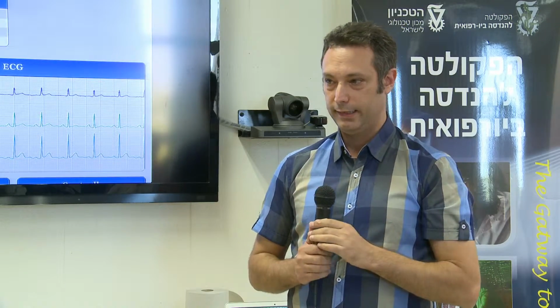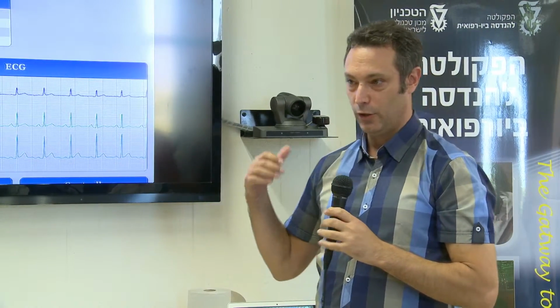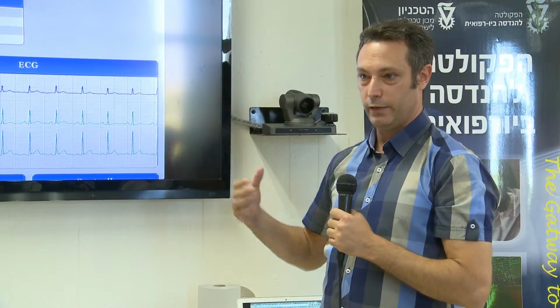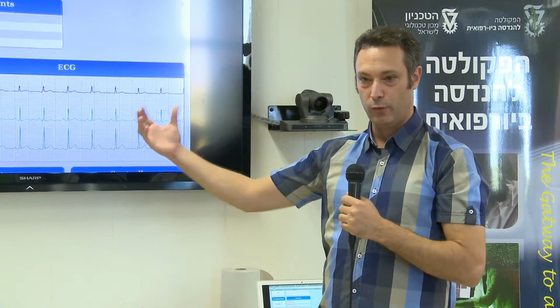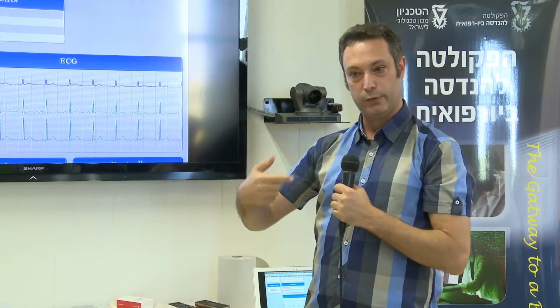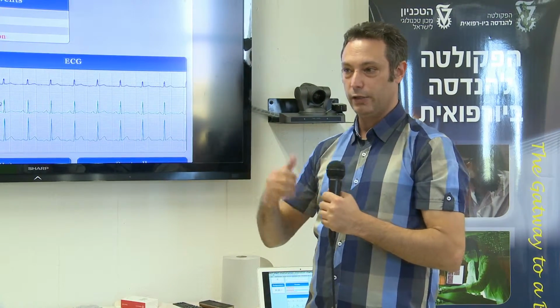today, for me at least, and what we saw the patients complaining about, so obviously they don't have it, is remote monitoring. So in this system, some caregiver can have this site open on a tablet when he goes shopping and the patient is at home, and he can see what's going on. Maybe he can even operate some stuff, turn on the nebulizer for him. Maybe he can call somebody.